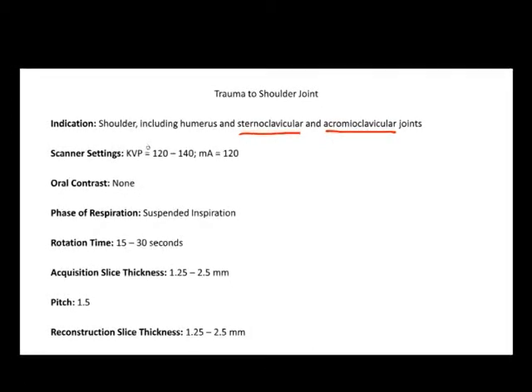Settings are going to be KVP 120 to 140 and mA going to be 120. Oral contrast is not going to be required for this due to where you're going to be scanning and the high probability of motion if respiration is continued. Definitely want to suspend respiration at inspiration.